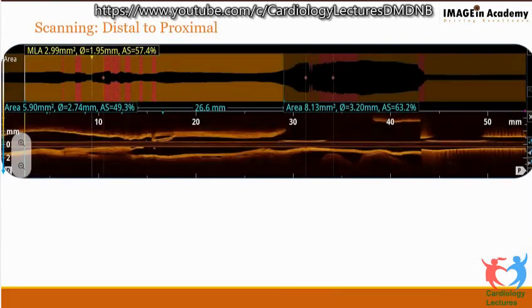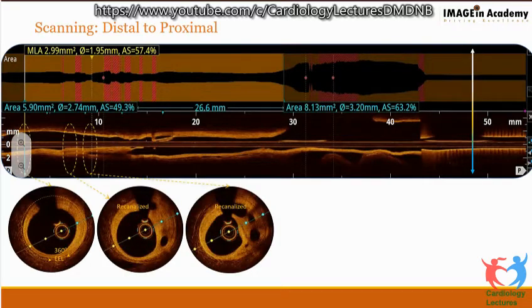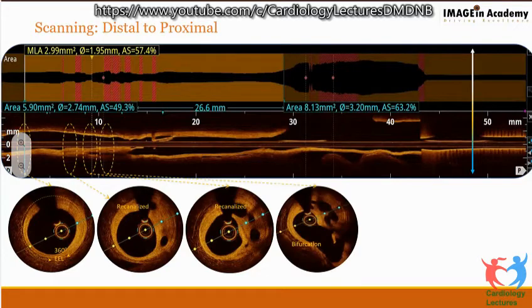Now this was done with angio co-registration. We'll see how it helps us. So we're trying to identify the proximal and distal references. So this is a healthy zone. This is where the thrombus burden begins to show up, and there is some amount of recanalization of this thrombus. This gives you a comb appearance, or a lotus stem appearance as people also call it. These are chunks of septae which are there.